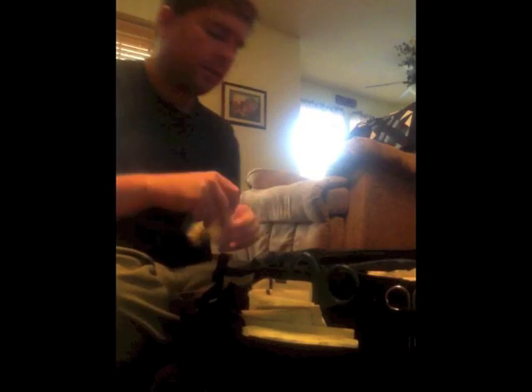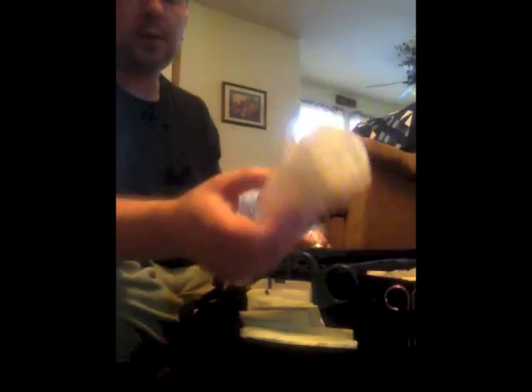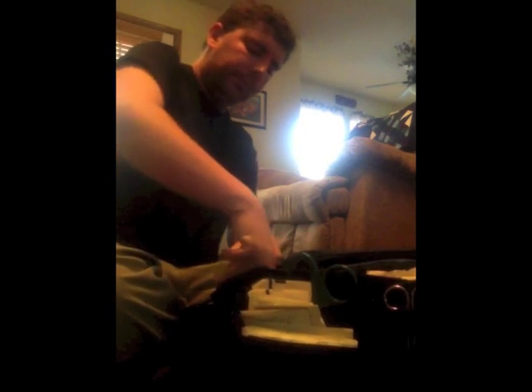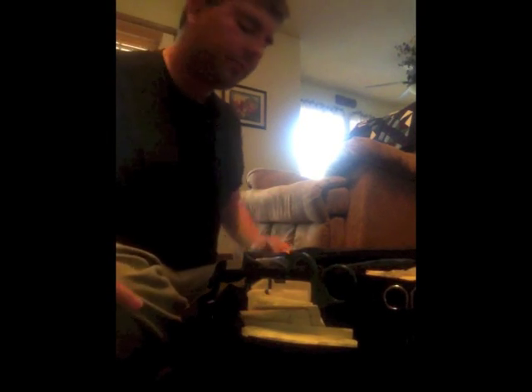And then I have some plastic cups wrapped up here. I just wrapped them up in some plastic wrap. I have these cups for when I need to irrigate something, because I will show you later on, I do have irrigation syringes. I'll put the antiseptic wash in the cup and just suck it out of the cup. It makes it easier because the syringe doesn't fit in the bottle.